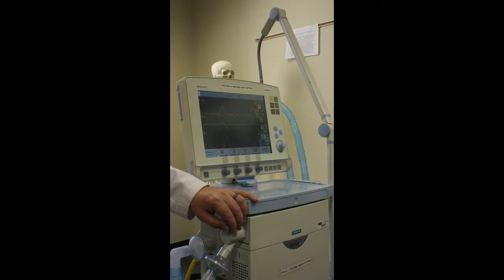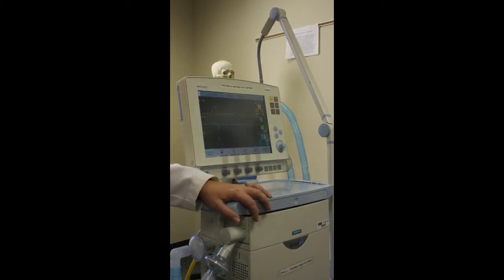And what would cause, let's say I have my PEEP set at 4 and I have an actual PEEP reading of 10? What could that signify? There's an obstruction going on? Maybe resistance? Increased resistance, causing what? Our PEEP reading is at 10. Low compliance? No. Air trapping. The patient's not exhaling, and so it's getting trapped in there.